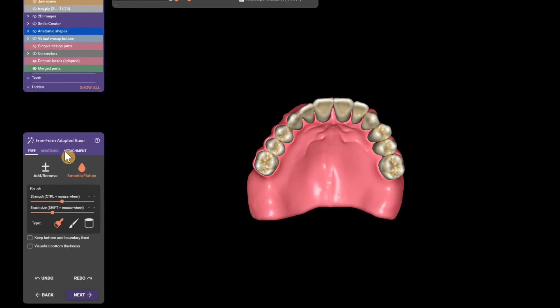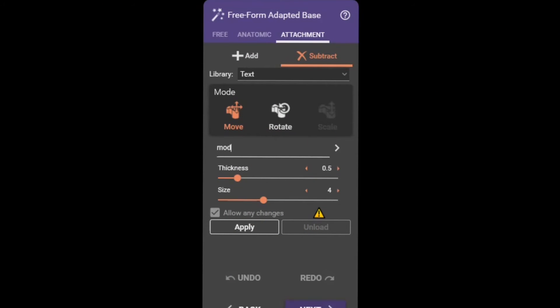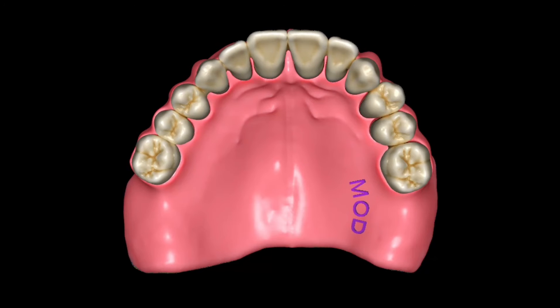In the same tool, go to attachment over here, then go to library, scroll all the way down to text, type your patient's name in the box, and set the size and thickness you want it to emboss into the denture. Then just click anywhere on the denture where you want the name, and it's going to instantly cut the name in.